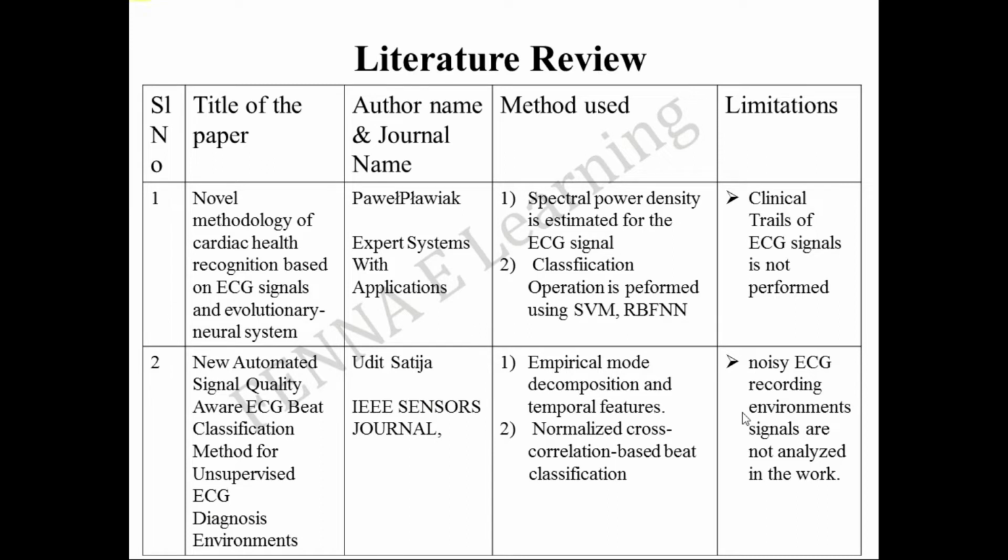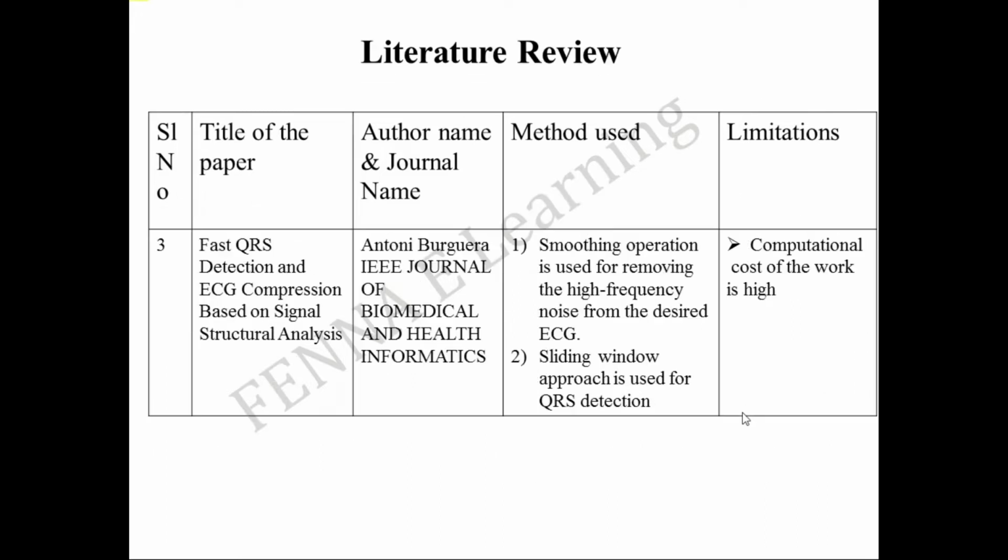In the second paper, empirical mode decomposition and temporal features are analyzed. Normalized cross-correlation based beat classification is performed for ECG classification. The major limitation of this work is that the noisy ECG recording environment signals are not analyzed in the work. Filters are not properly used to remove the noise from the ECG signal.